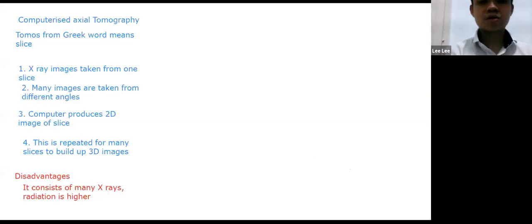Going to discuss about CT scan. Okay, so I will share a screen on the board now. So CT scan is coming from a term representing computerized axial tomography.